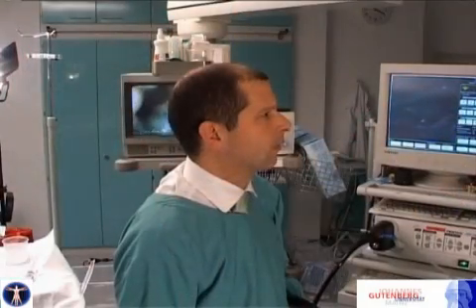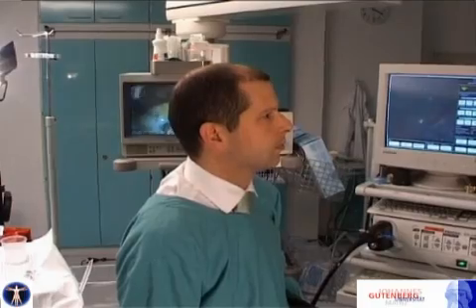Handling of the endoscope is similar to a standard video endoscope. Endomicroscopic images are displayed on a second monitor. The endoscope is advanced over the esophagus. The blue laser beam is readily visible onto the mucosal surface.